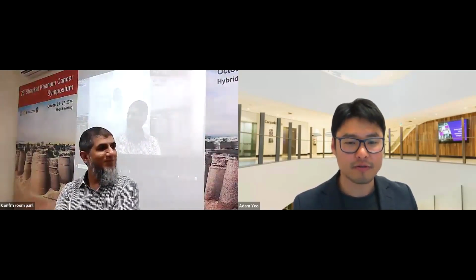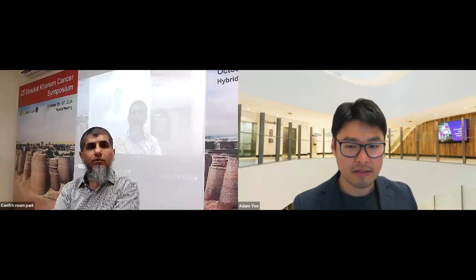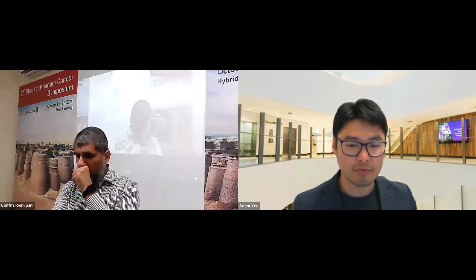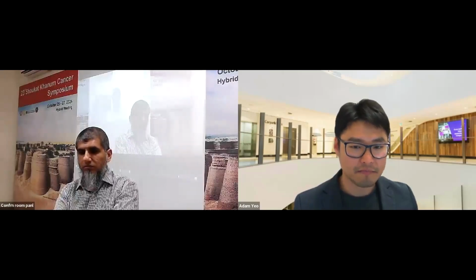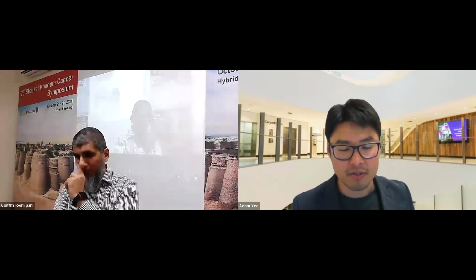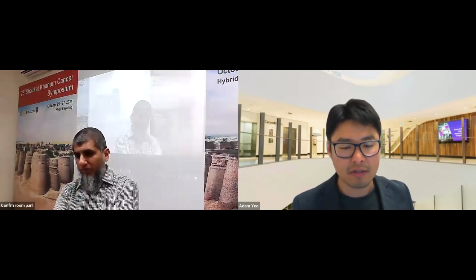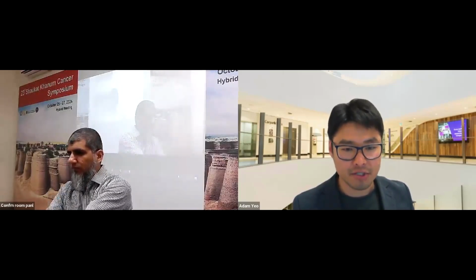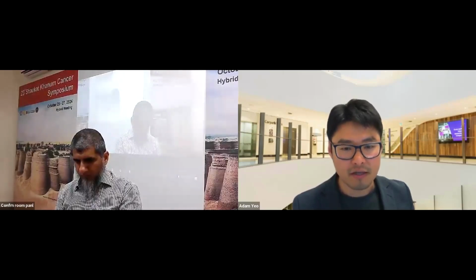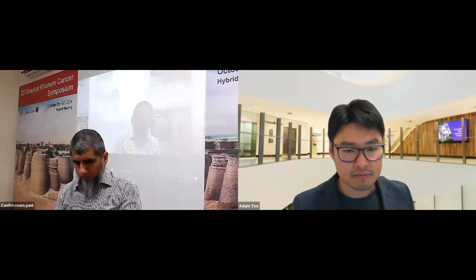Because with a 6D couch, if it's integrated with your machine, the couch correction can be done. The only recommendation is that it's better to image at the treating couch angles. Some couch angles you cannot do with direct OBI imaging, but it can be done. So I don't think that's an absolute requirement. In a number of our clinical trials for SRS and SRT, we don't make it mandatory, but we make it desirable. We put a requirement of capability of imaging at the treating angle. We don't specify commercial solutions, just a requirement as a good clinical practice.